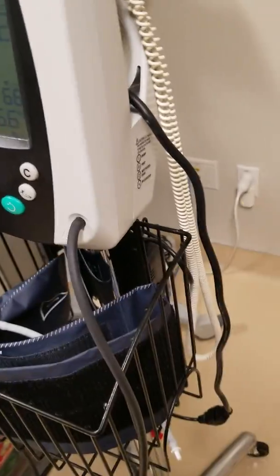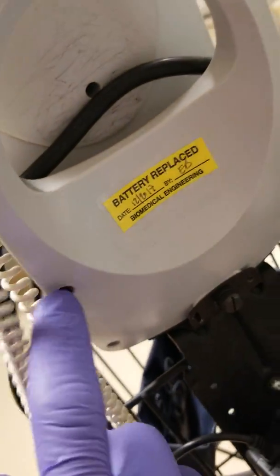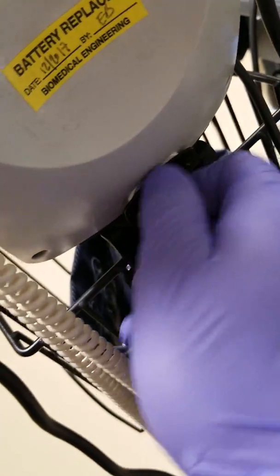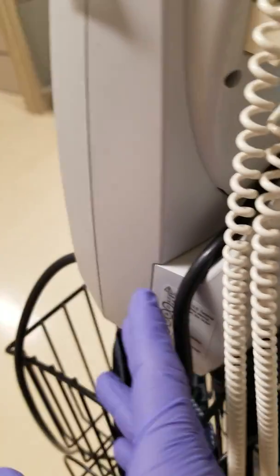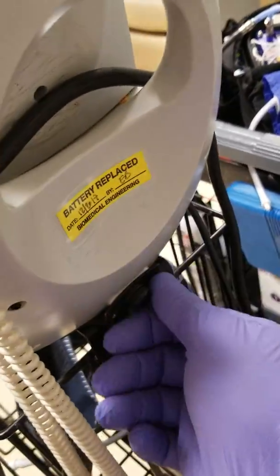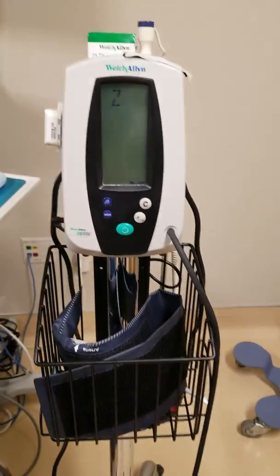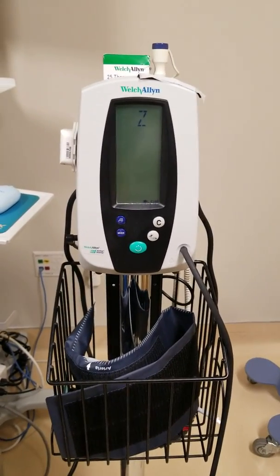We also change the battery as part of preventive maintenance, since this uses a lead-acid battery. The battery is housed inside — you remove these four screws, untwist the cover, and it comes off. You can then flip it upside down on your cart to remove the battery. We do this every two years. We also recommend that the unit is always kept plugged in. And that's preventive maintenance on a Welch Allyn vital signs monitor.